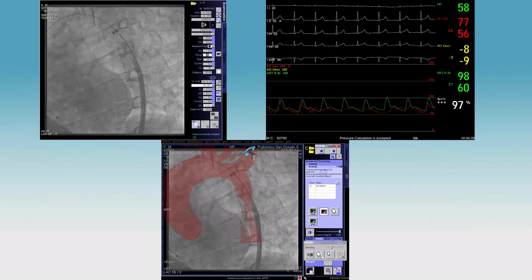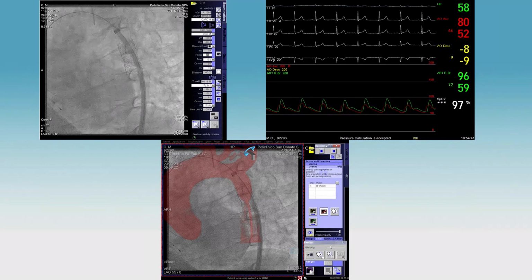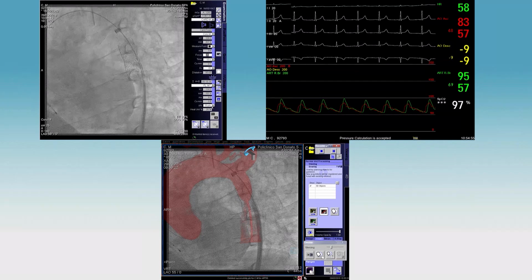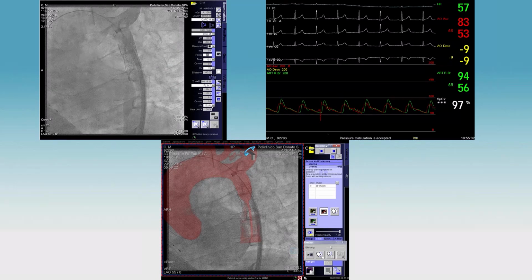So what do you think of that at the moment? Do you think that looks reasonable? Oh, it looks good. As opposed to the wall, I think it's fine. We'll do a proper angio in a minute, but I think the top end is nicely opposed to the distal aorta, and it matches the diameter. The bottom end, I'm not keen on flaring usually. Occasionally I flare if there's a huge discrepancy, but what do you think about flaring, Carlos or Amy?